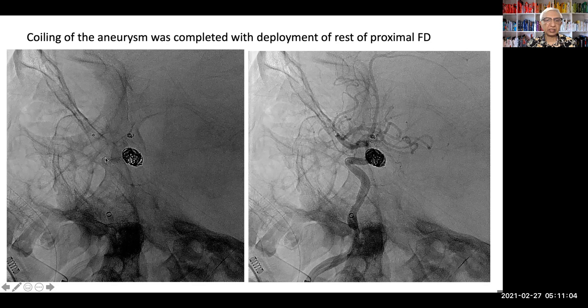So you can see this. This is finally open. We do not know what length you actually need to open this here, and that's why you need that extra length to do this maneuver. Otherwise, you'll be stuck with hardly any segment here, and you will end up not able to open the segment. And sometimes they can be so tight, even a balloon will not go. So look at the end result. It looks pretty okay. This segment is definitely opened up well.